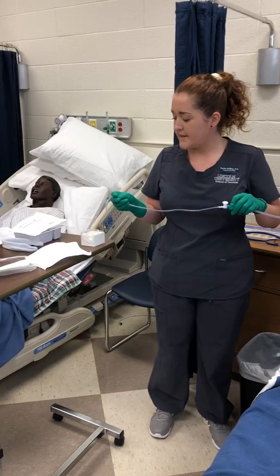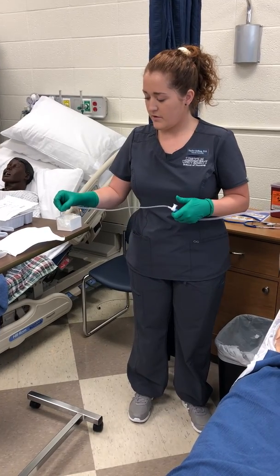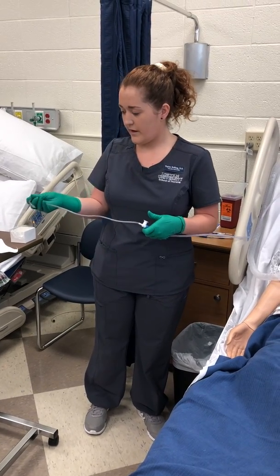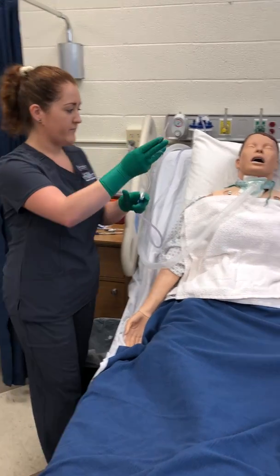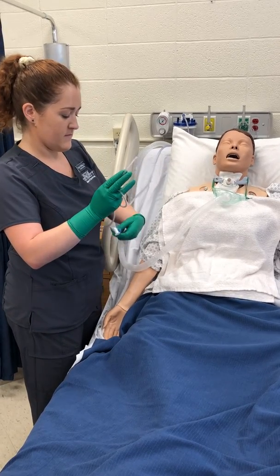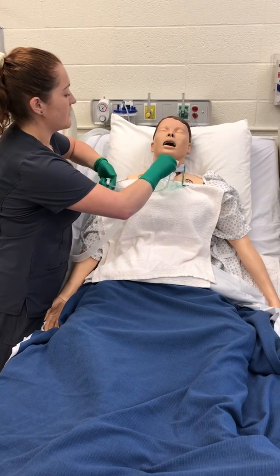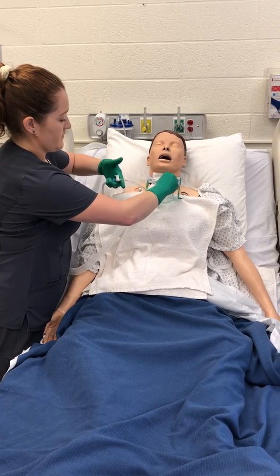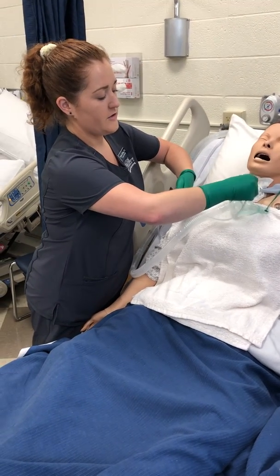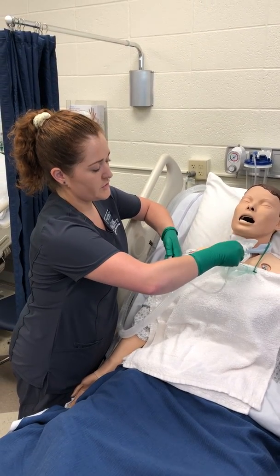Now I'm going to test the suctioning. The suction should be between 80 and 120 millimeters of mercury. This is lubricated and it is working. I'm going to remove the patient's oxygen and insert the suction catheter.